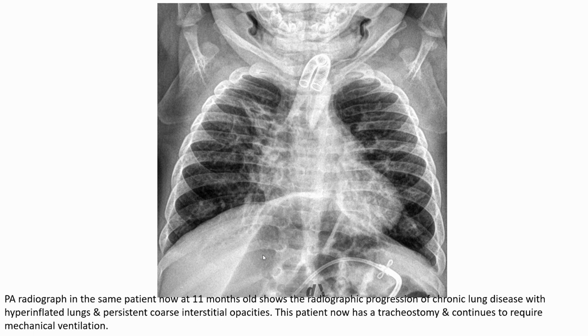This is a PA radiograph in the same patient. Now he is 11 months old, showing radiographic progression of chronic lung disease with hyperinflated lung and persistent coarse interstitial opacity. This patient now has a tracheostomy and continues to require mechanical ventilation.